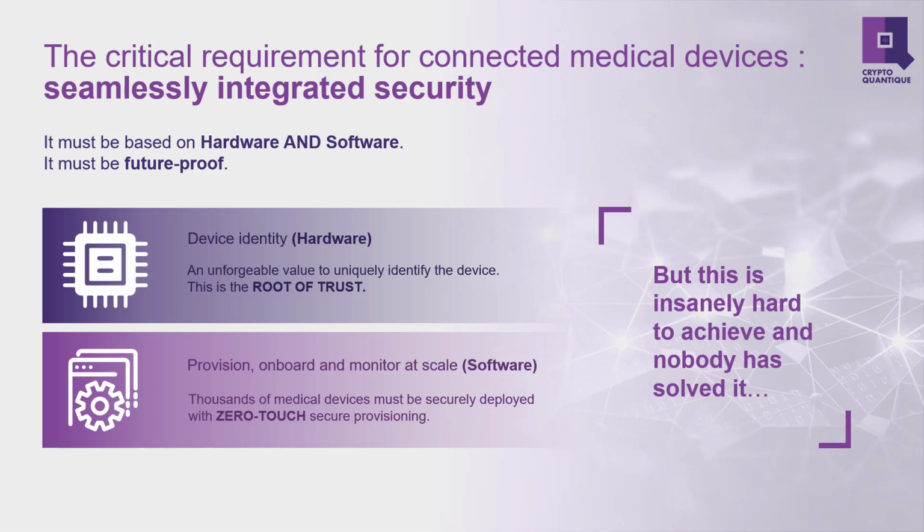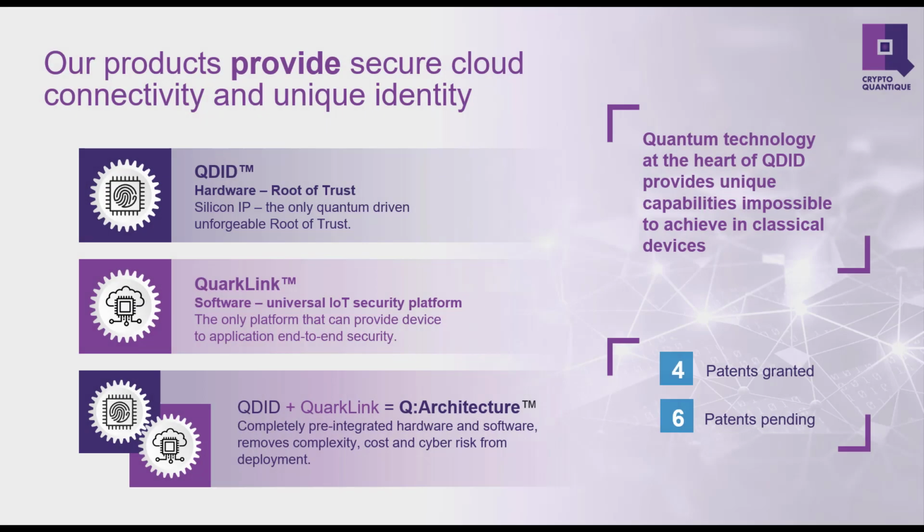But one of the problems in the industry today when it comes to connecting devices to the internet, it turns out, is that it is extremely difficult to provide both a hardware root of trust and software to allow the connection of these devices to cloud services at scale. Nobody so far has been able to solve this problem seamlessly. Apart from Crypto Quantique, of course, with their Q architecture products, the QDID and the QuarkLink.